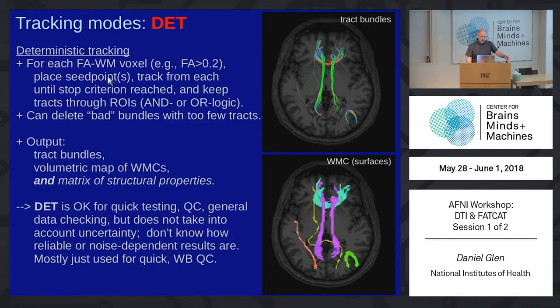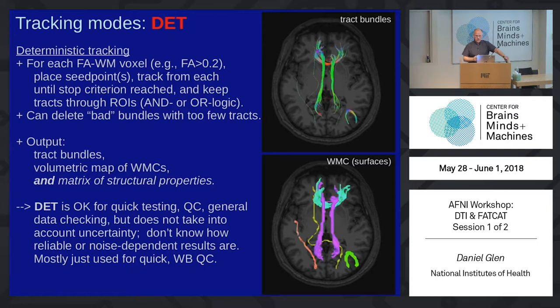We have tractography — this is the first one, the simplest case: deterministic tractography. We're just looking at the simple FACT-ID on the data as it is, and we look to see whether one seed point connects to another. We overseed it to get this result. Deterministic tractography gives you results like this — you can make surfaces out of it with SUMA. It's okay for quick testing and also fun to explore with. But it's going to have a lot of dependence on noise in your data. We're going to try to handle the noise through two other kinds of tractography methods.